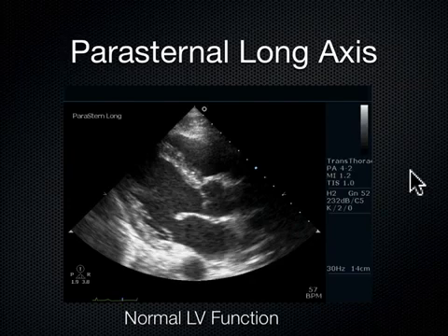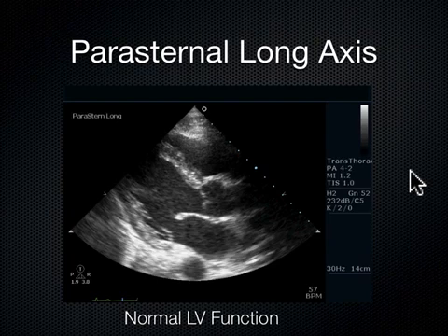So one thing you can do, if you want to take the time to do it, you can actually measure the left ventricle at the end of diastole, and you can drop some calipers we call discs through there. There's several ways to do it, but you can imagine you could trace the area of the left ventricle cone at the end of diastole, do the same thing at the end of systole, and the machine will calculate the ejection fraction as an actual number.